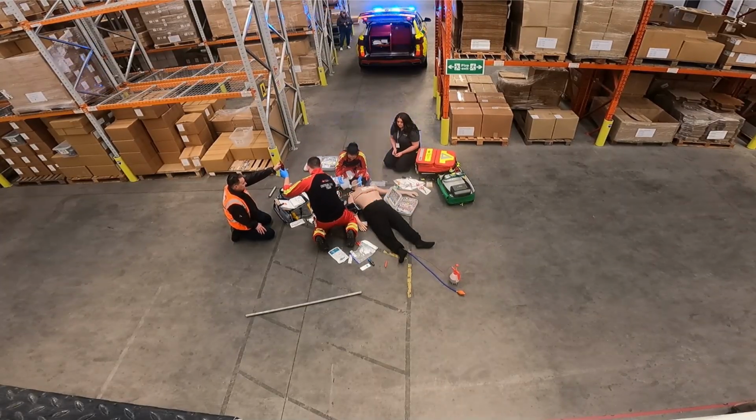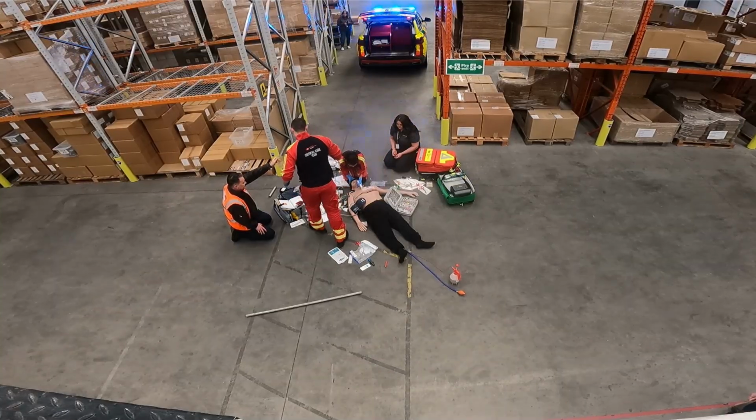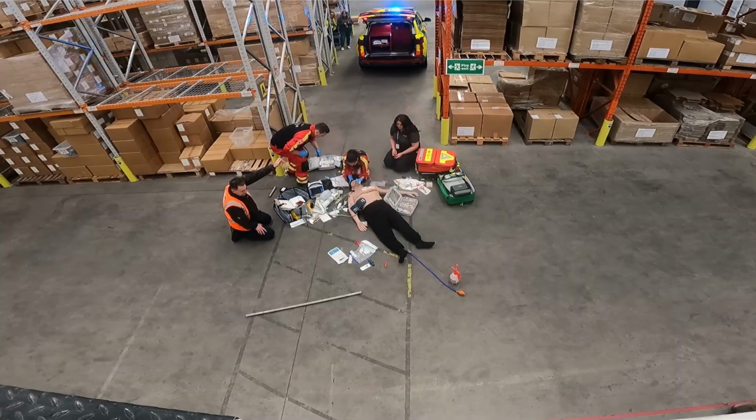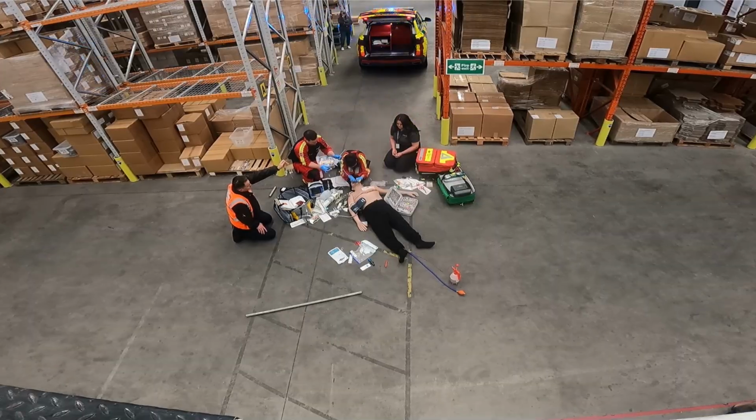Okay, that's ready. Could you just pass me the bougie? Okay, going in, sweeping the tongue. Okay, so I have a grade 1 for you. Thank you very much. Sorry, the bougie. Okay, that's through the cords. Tube, please. Loaded on the bougie. I've got the tube.